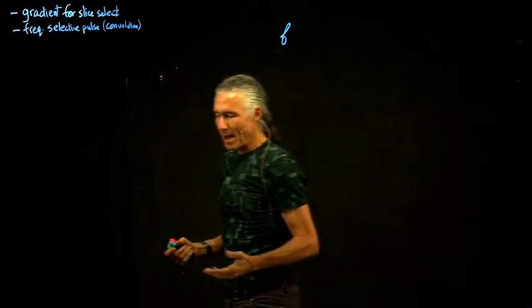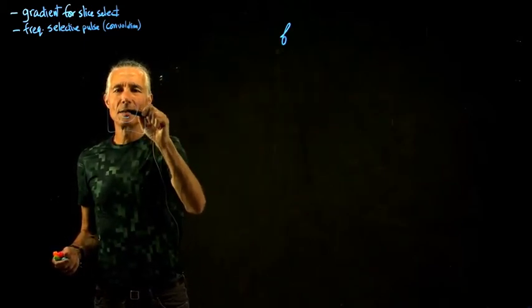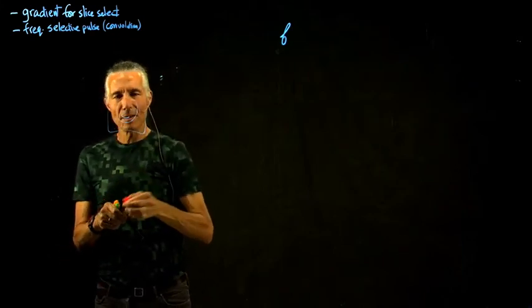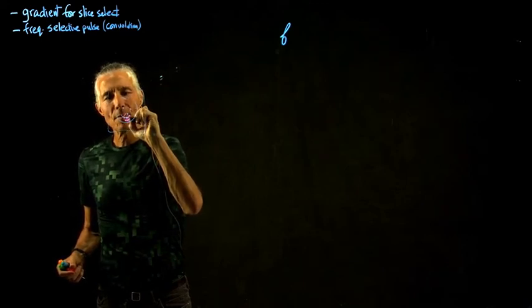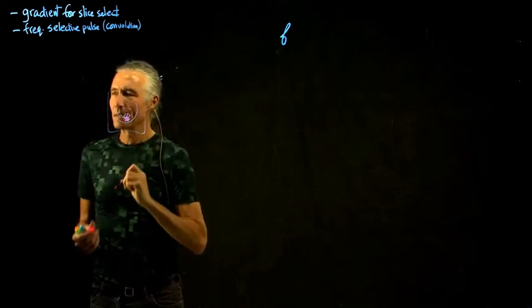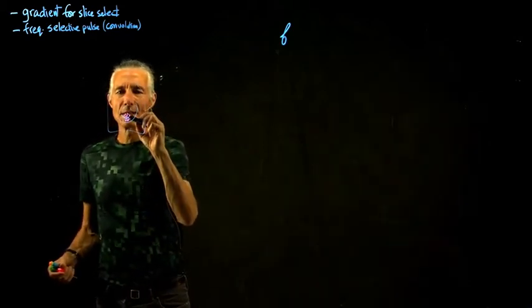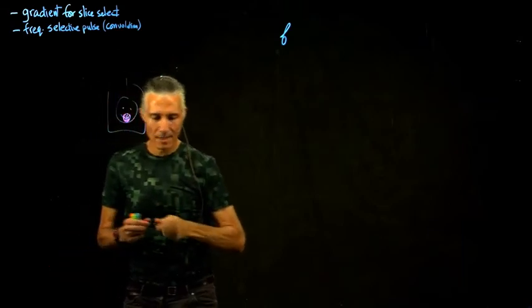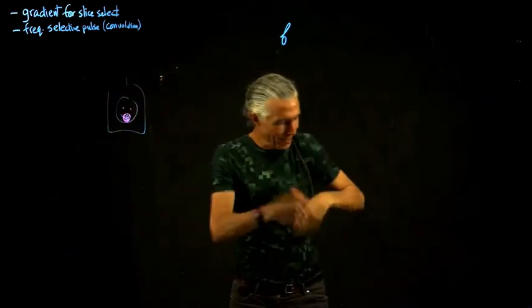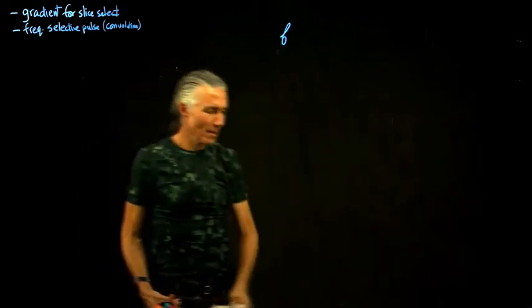And how do you blur an image? Well, if you've got an image here, you go to some part of the image, and then you look at points around that point and mix them in. So that's what a convolution is fundamentally going to do. It's going to use some function, like a circular function, to mix in data from nearby points. And you can see convolution is kind of like turning inside out. That's kind of the name of the convolution.